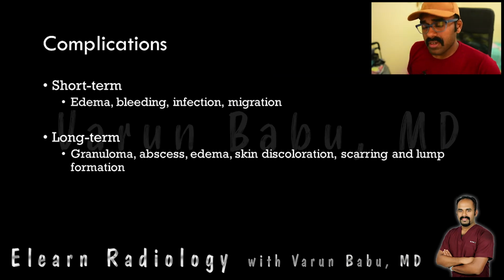Fillers can obviously cause complications. In the short term, there could be edema, bleeding, infection, migration. In the long term, there could be granuloma, abscess formation, edema, skin discoloration, scarring, and lump formation.